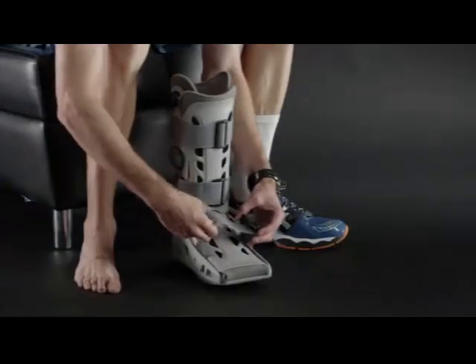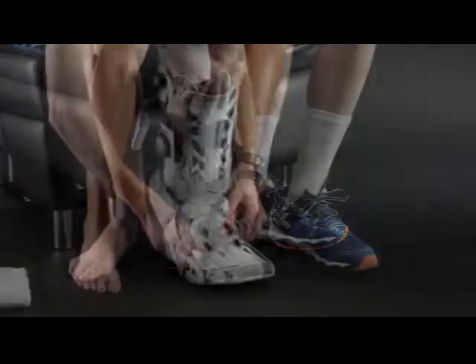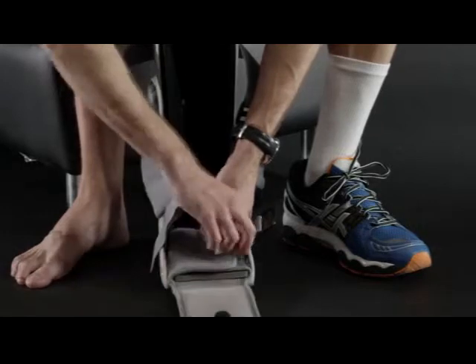To prepare the AirSelect Elite, unfasten the straps, remove the front panel, and open the toe cover and foot flaps.